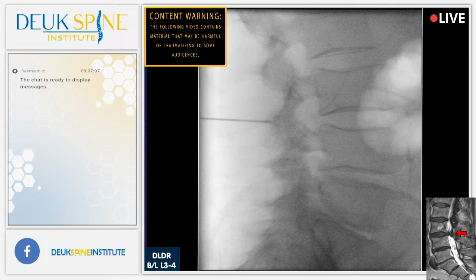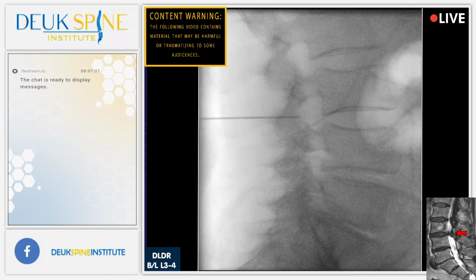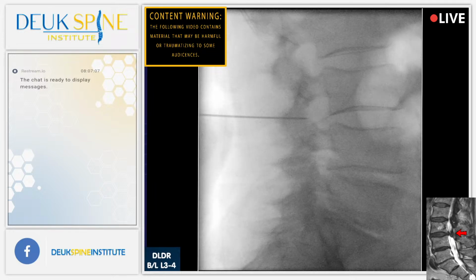So Arias, someday, hopefully you'll be doing these procedures. The key to avoiding nerve root injuries is to go into the foramen in the bottom half, where I'm going right now. Can you hear me, Arias? He's giving the thumbs up, yes. All right. So you see how the needle is in the bottom half of the foramen?